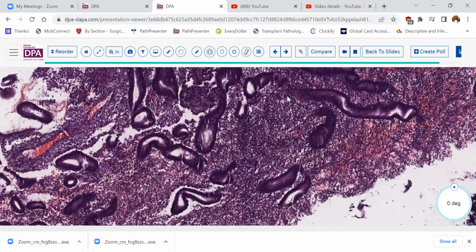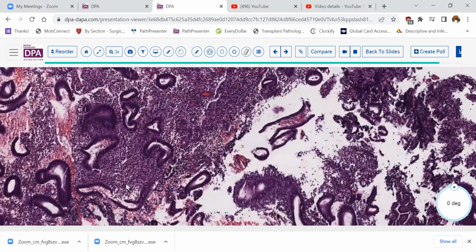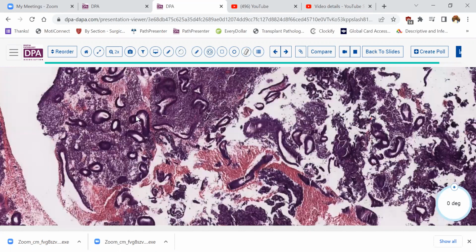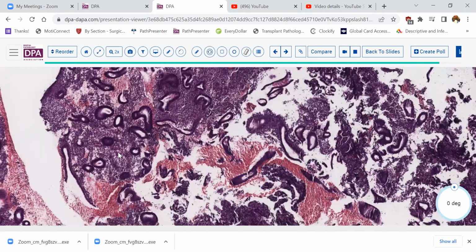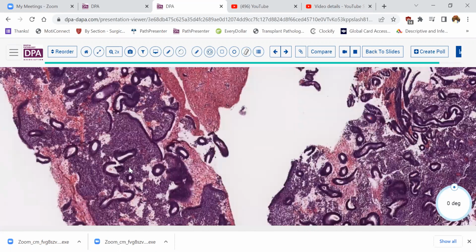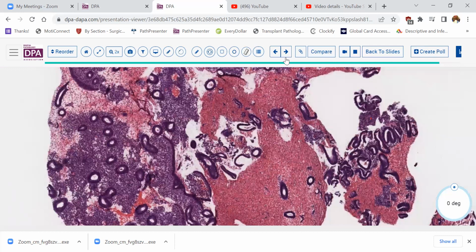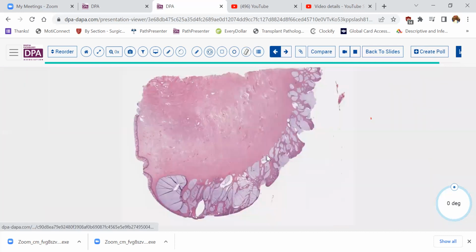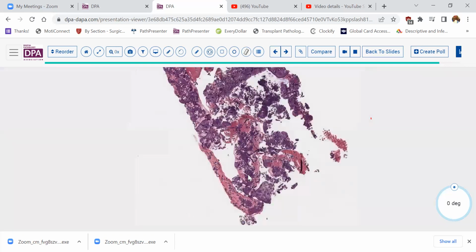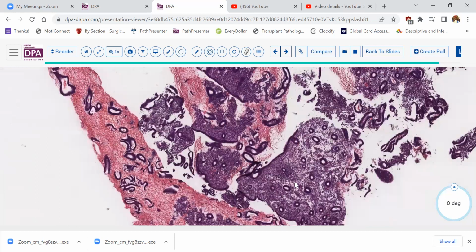She had a few areas of maybe a lymphoid-like aggregate. The sections here are a little bit on the thick side. And you see a little bit of variation in the shapes of the glands. So I don't know exactly all the reasons why I felt prompted to do a CD138 stain, but I did. Oh, I guess I'm not going to be able to show it to you. I thought I'd included it here, but this is a case of chronic endometritis.